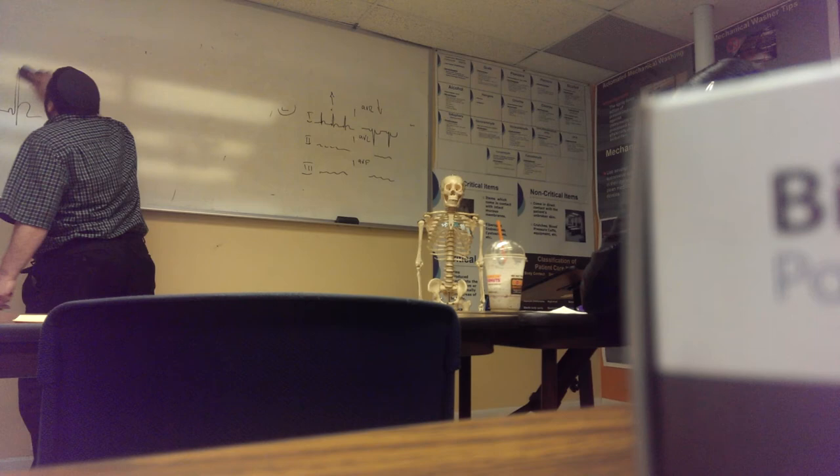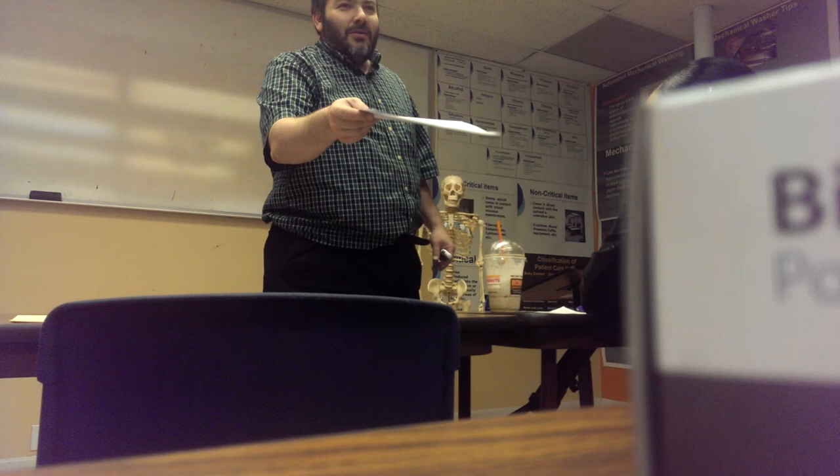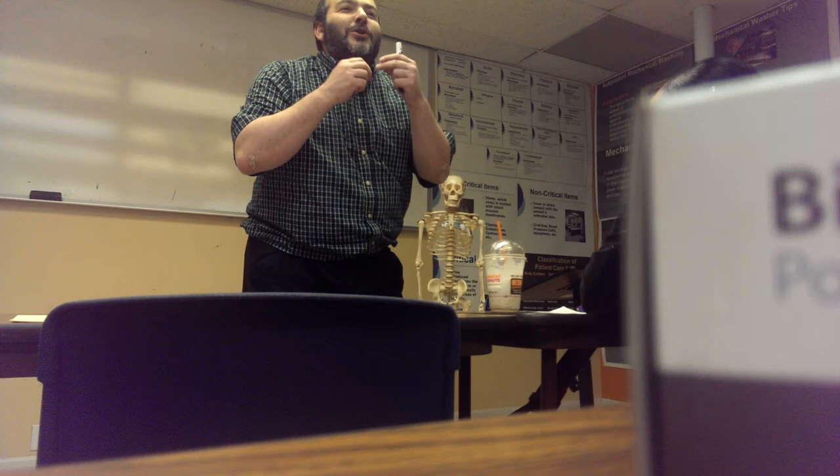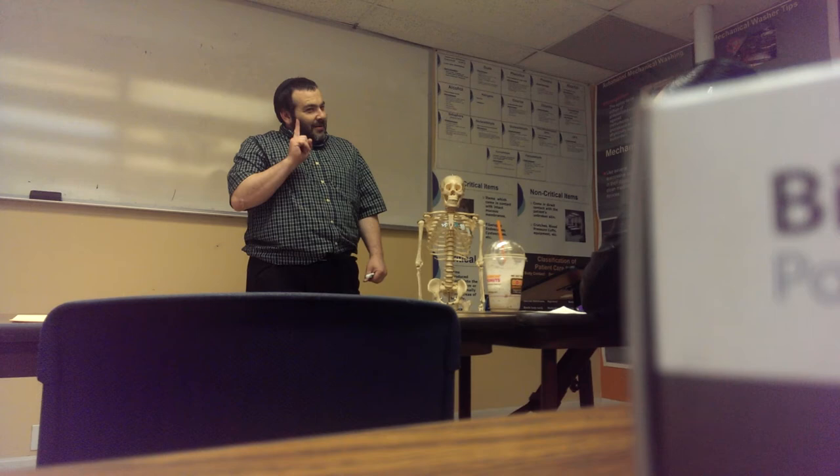Look, if the leads are reversed and you didn't notice, and the doctor says, Steve, go and redo this, you made a mistake. Oh my goodness, doctor, I'm so sorry, I crossed the wires. At least you answered the question correctly. You know what you did wrong. But oftentimes they'll just throw something on the table and say, hey, redo it. Why? It looks good to me. Be self-critical. Assess yourself and see, what did I do? Most common mistake.